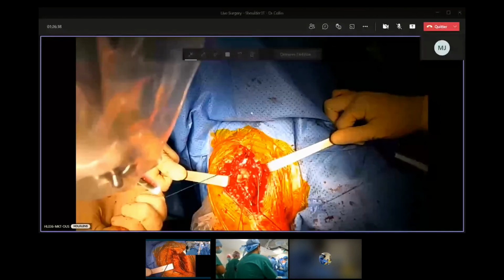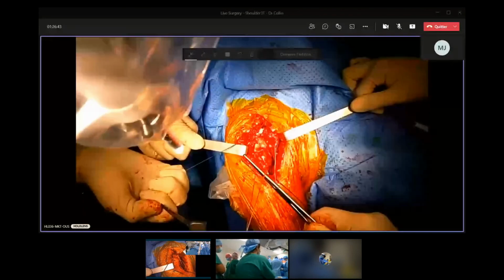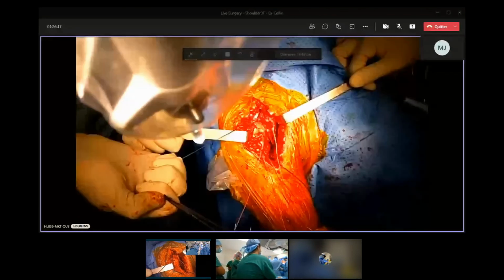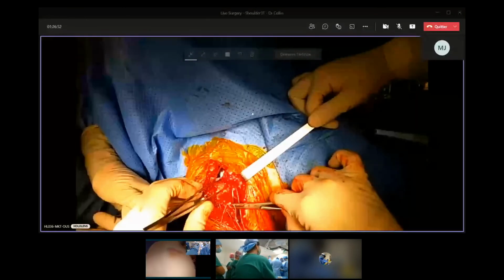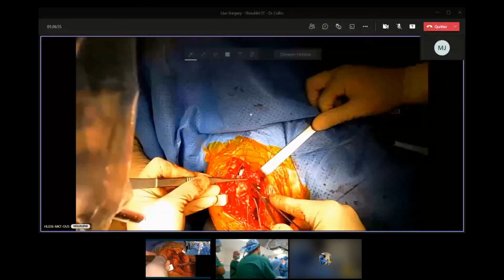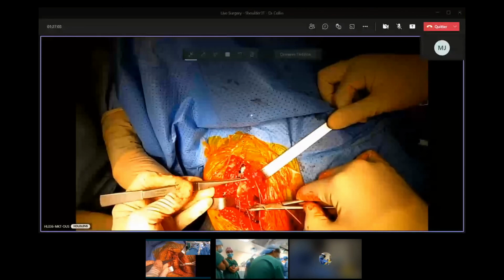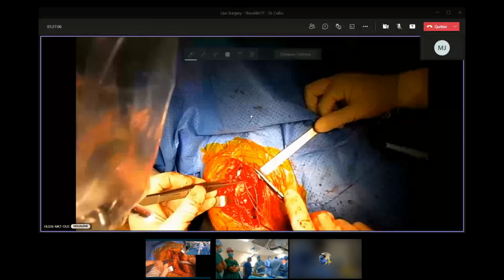And I can say that we are going to have, I think, as soon as possible, the guidance. This is only the first step. The guidance will be something very revolutionary. No need of PSI anymore. If you want to create a PSI, you can do it 5 minutes before surgery. It's going to be very, very different in our daily practice.